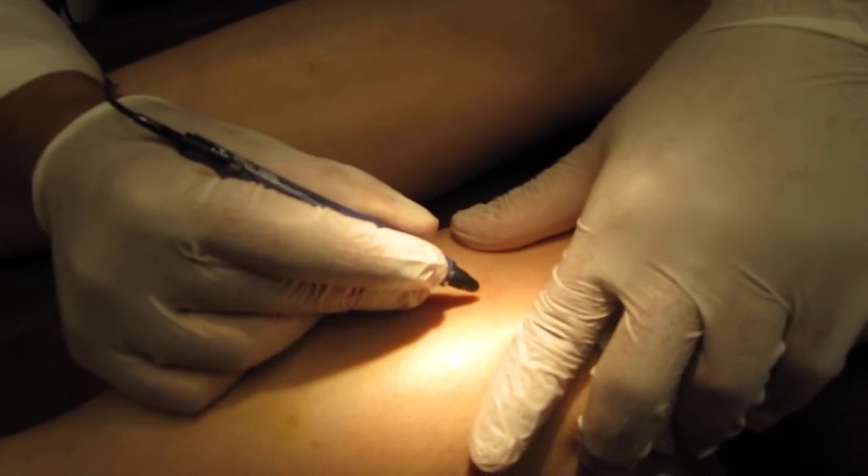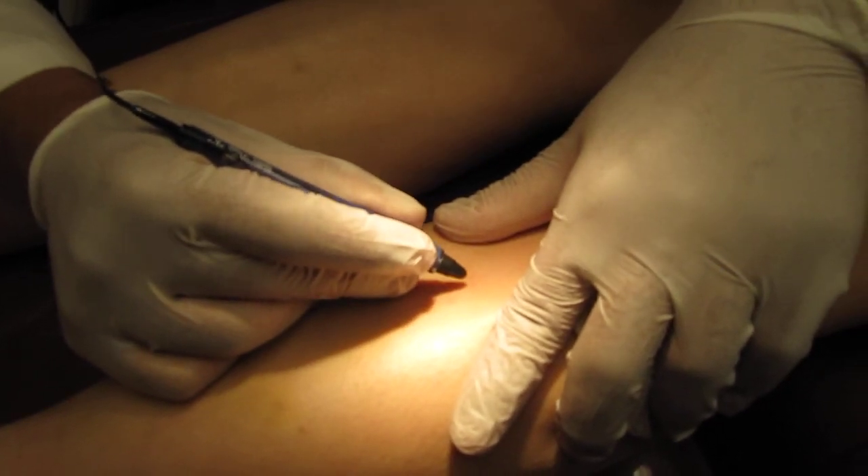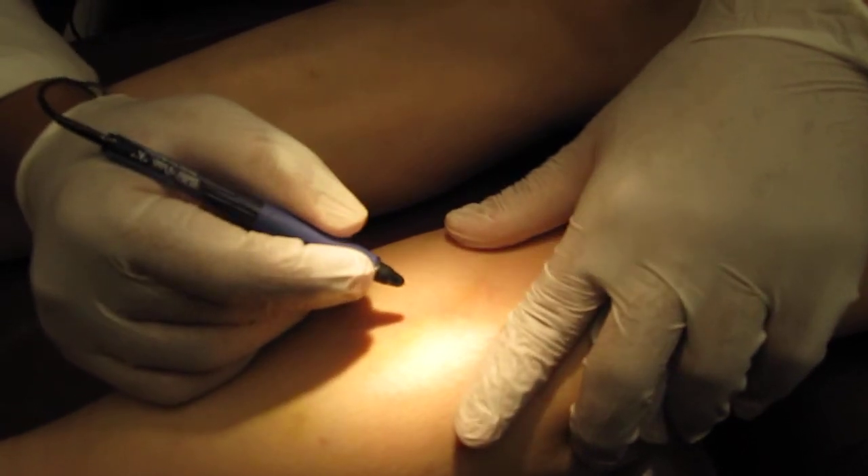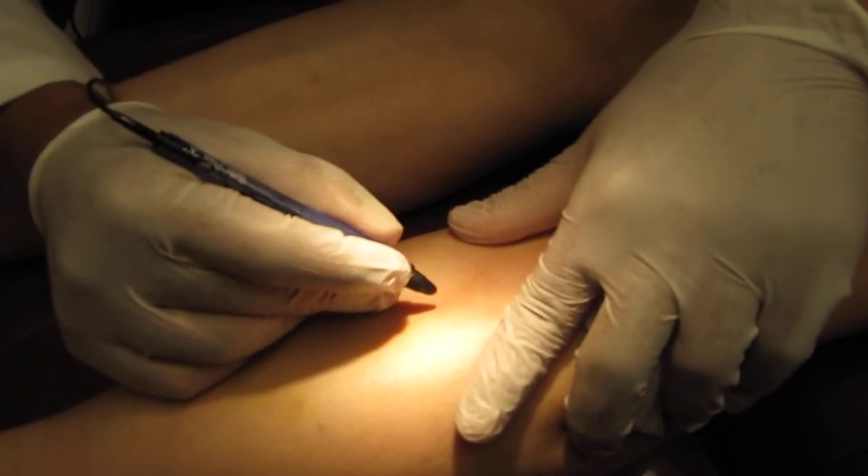Is it very painful? No. I go back and treat the area which I think is still open and continue the treatment.